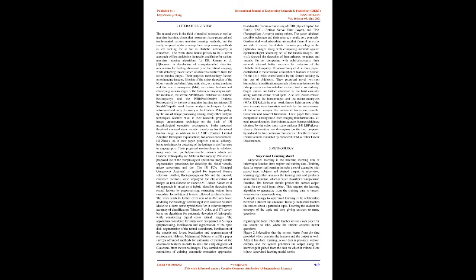Prasad et al. proposed the use of morphological operations along with segmentation procedures for detecting the blood vessels and microaneurysms, and PCA, principal component analysis, is applied for improved feature selection. Further, backpropagation NN and the one-rule classifier methods were deployed for classification of images as non-diabetic or diabetic.